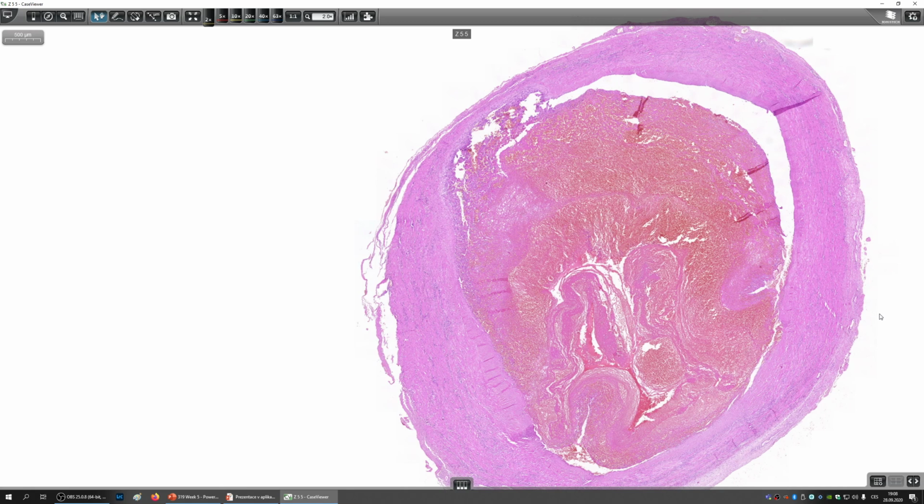Or if the thrombus has completely organized, it can also calcify. You see this in varicose veins of the lower limb. These are the so-called phleboliths. You see it in the lower limbs in varicose veins, or you can see it in the venous plexi of the uterus, prostate, and so on. So sometimes the organized thrombus, this tissue here, can turn into scar tissue and organize, and then calcify, and through dystrophic calcification, you might get phleboliths.